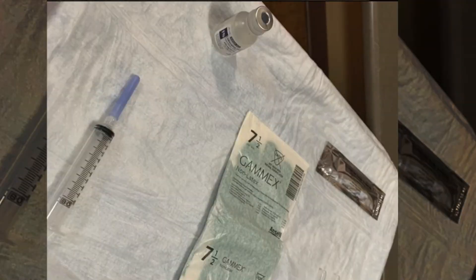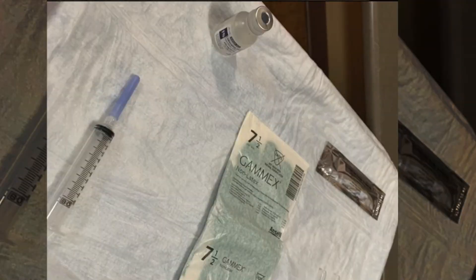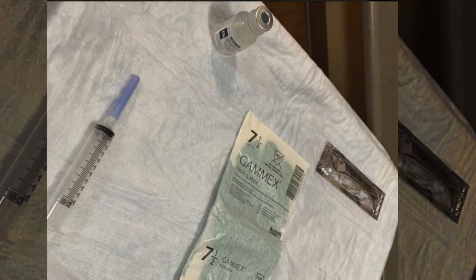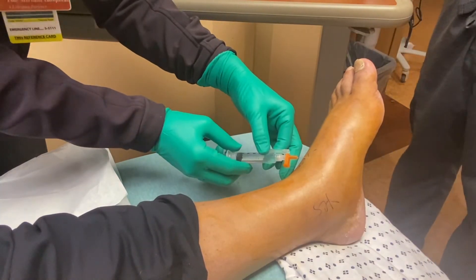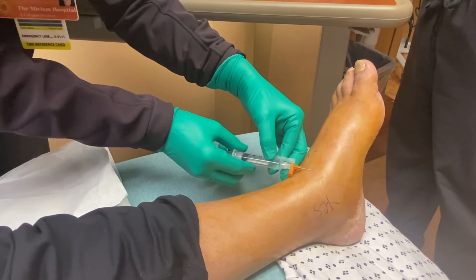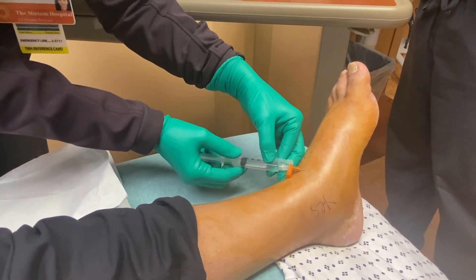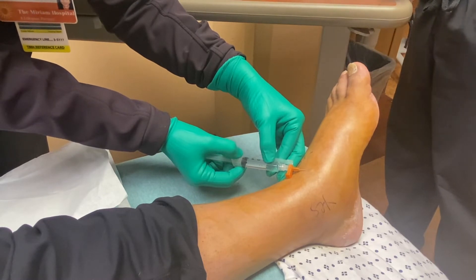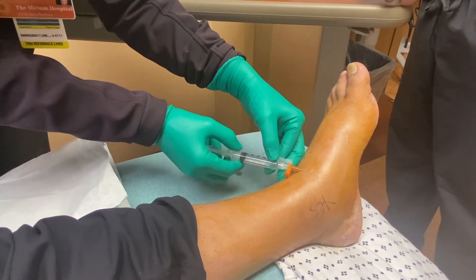The second step of the procedure, after you've palpated your landmarks, is to apply antiseptic solution. Allow the skin to dry. Apply a sterile drape if it's available. The third step will include injecting 1% lidocaine with a 25 or 27 gauge needle to create a wheal at the skin, and then infiltrate deeper into the tissue toward the joint space.